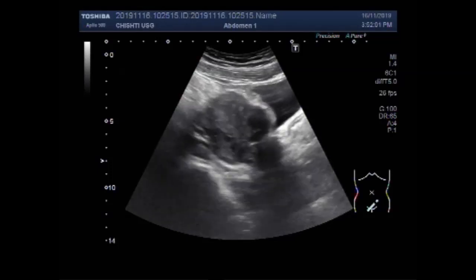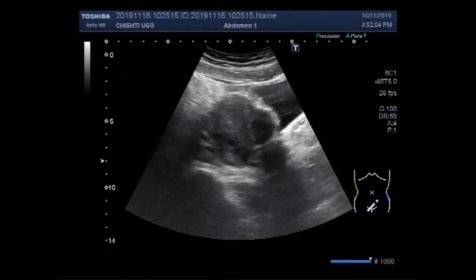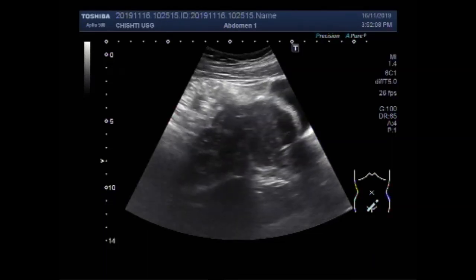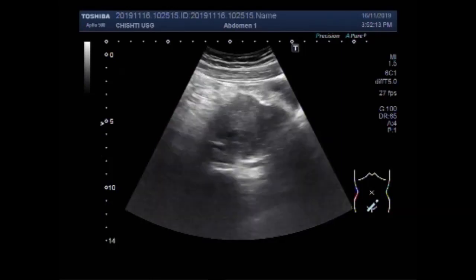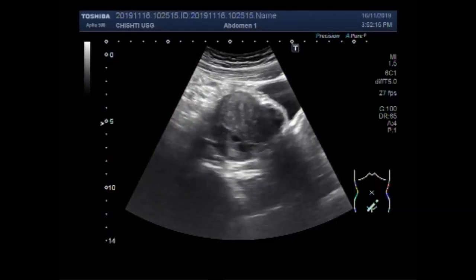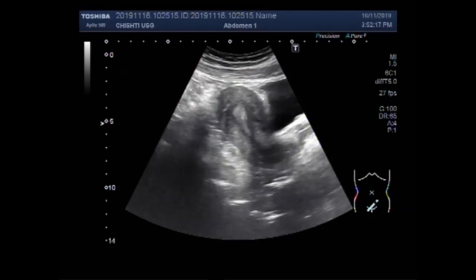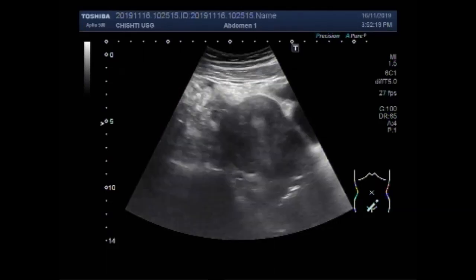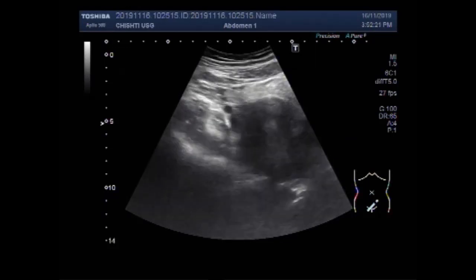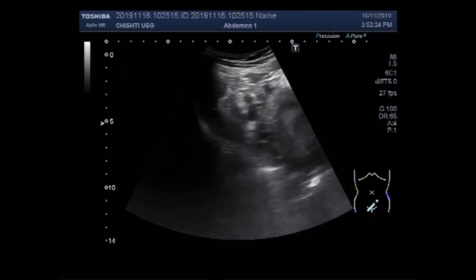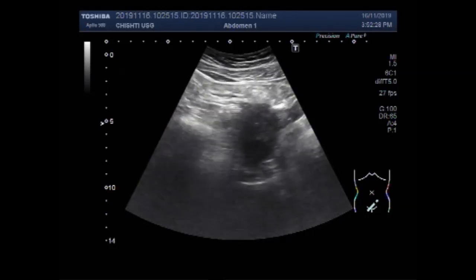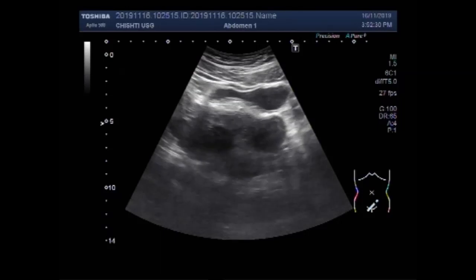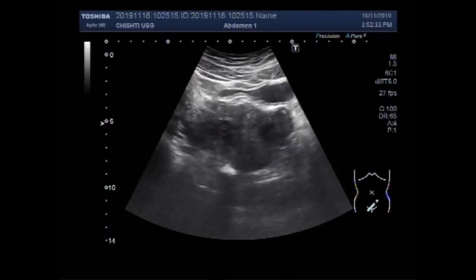Now you can see this fibroid along the anterior wall. Intramural fibroids are the most common type of fibroids; these appear within the muscular wall of the uterus and may grow larger, stretching the uterus to one side. Subserosal fibroids are formed on the outside of the uterus.